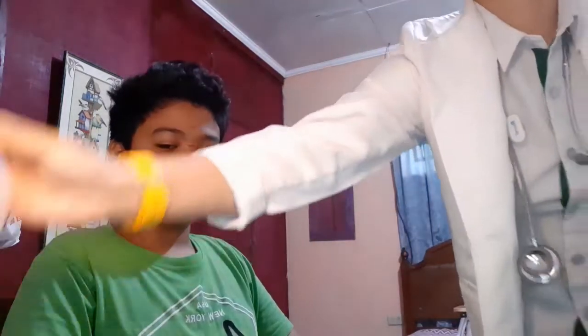Okay, so let's proceed to our main topic. Before that, I'm going to use alcohol for the patient and use gloves. Lastly is a mask, for safety purposes and protocol also. Okay, now let's proceed to our main topic.